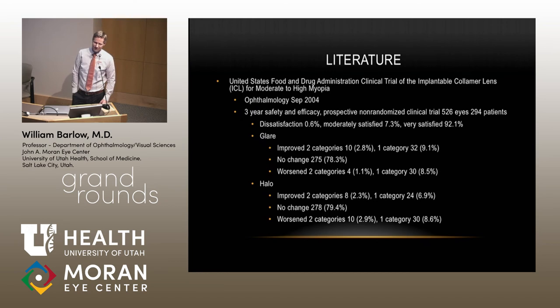If it does, maybe you could consider a cosmetic contact lens as the next step. Okay. Thanks. Well, that's what I was going to say. Maybe a plano tinted contact lens just to see if that would block the PI, to see if the PI is more likely the source versus the lens itself, if it's reflecting off the inside of the eye. I don't know how you might block the PI somehow. Just to determine. Thank you. Nick?